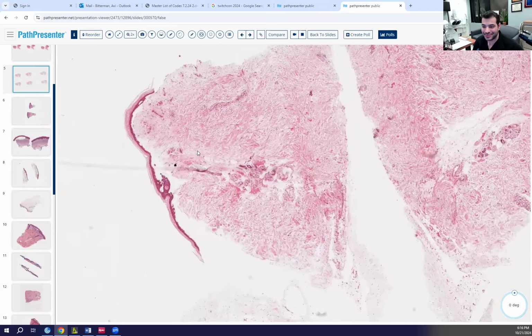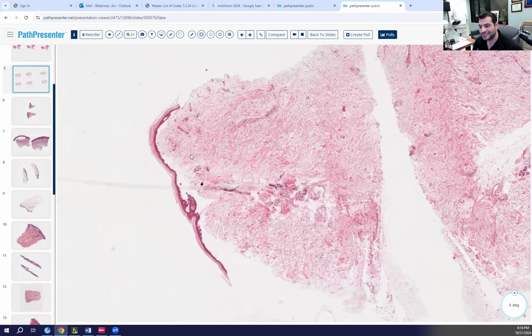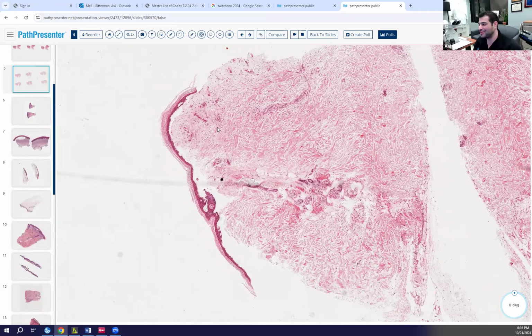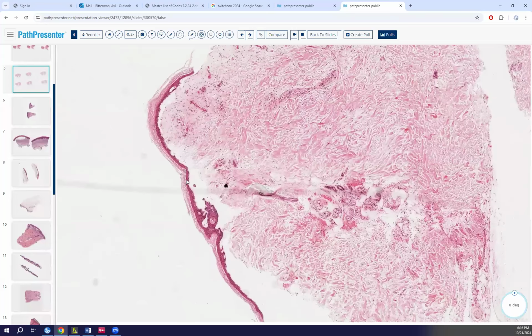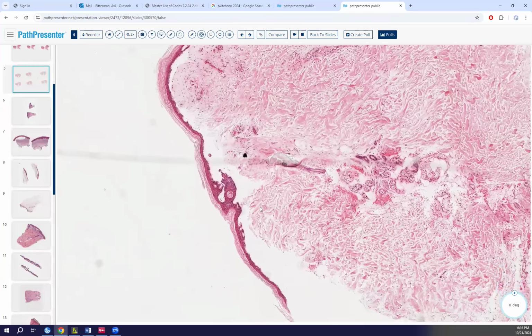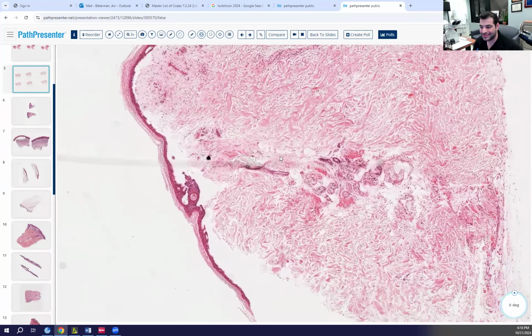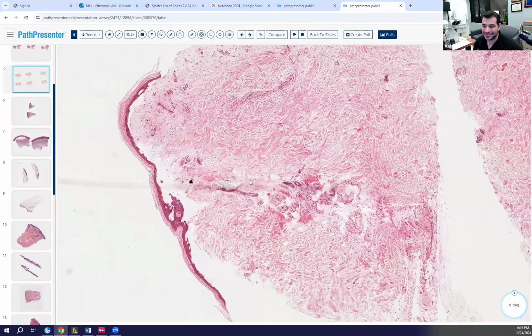What do we see here? Another subepidermal blister. It almost looks pretty minimal, there's not really an infiltrate. So this is good for that word that was used before, pauci-inflammatory, right? This is pauci-inflammatory. Not a lot going on. Does anything stand out?